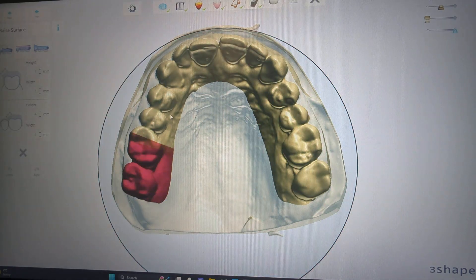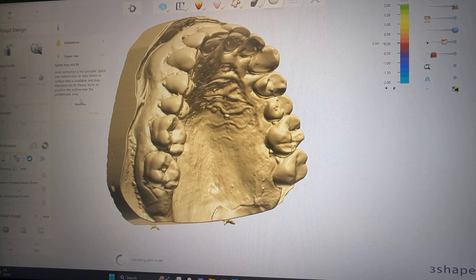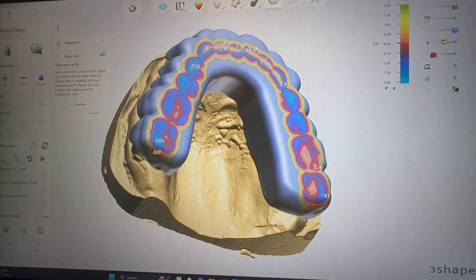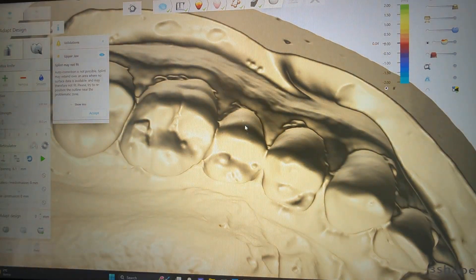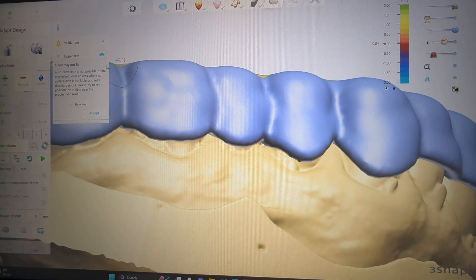Next I select always the flat plane, highlight the area, and click Next. It says: 'Splint may not fit — auto correction is not possible.' Let's find out — it will tell us after it calculates the splint whereabouts the area of concern is. It's probably going to be right back in there. There's probably a small little bite bubble — we're just going to smooth that out and see if that makes it better.